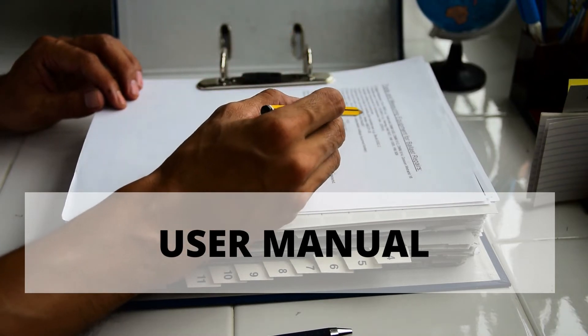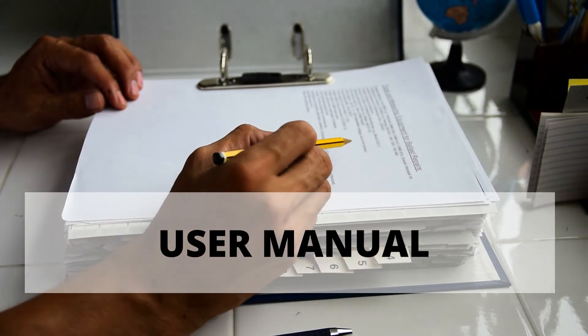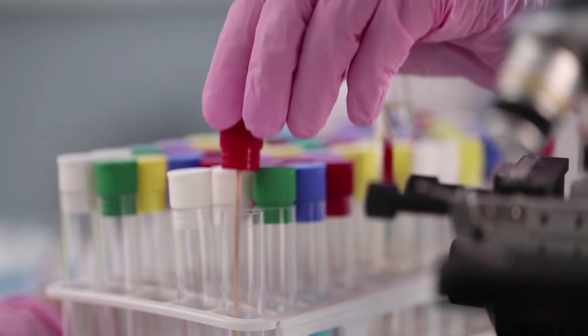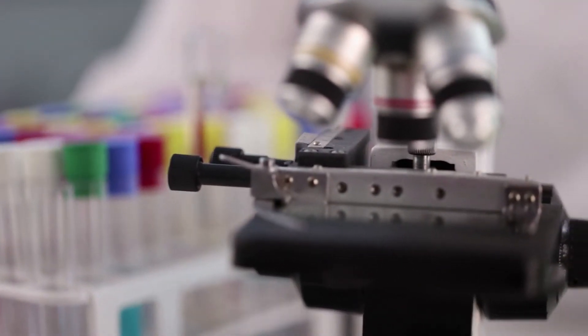It comes with an instruction manual covering cleaning, care, and storage of the instruments. All instruments conform to surgical instrument guidelines by EU and FDA. The instruments are reusable and autoclave safe.